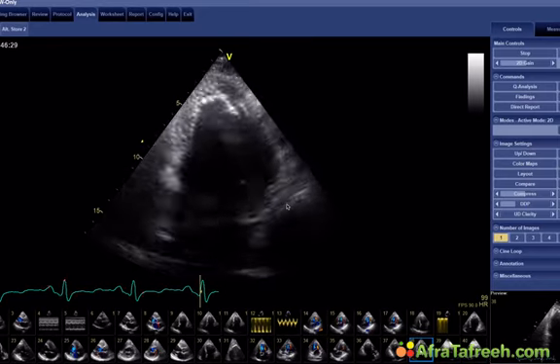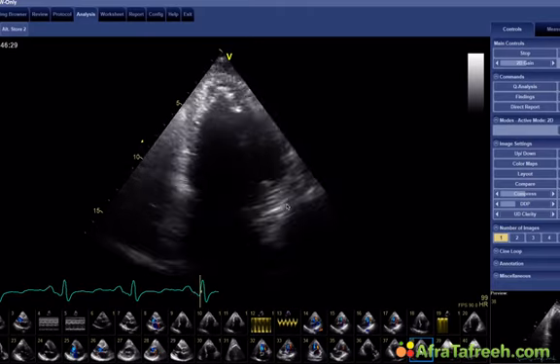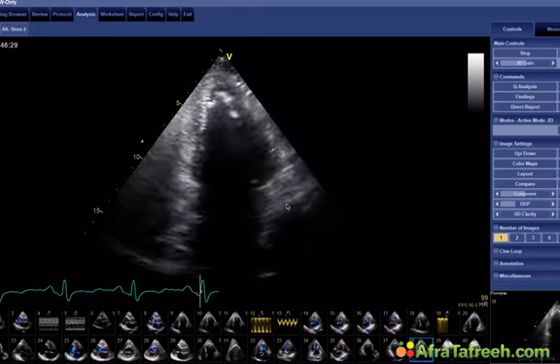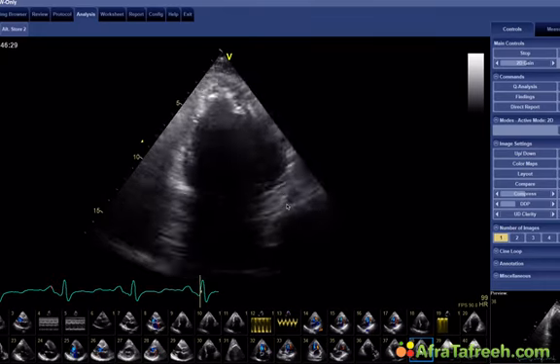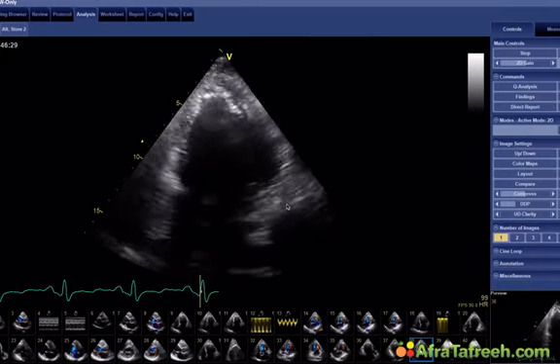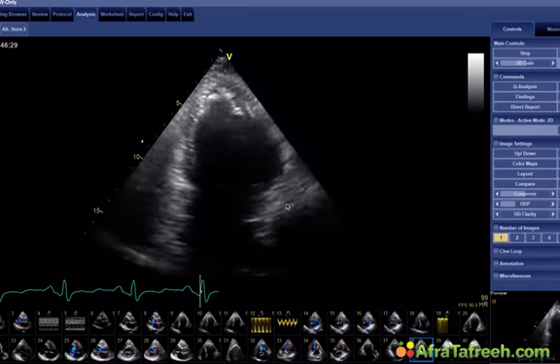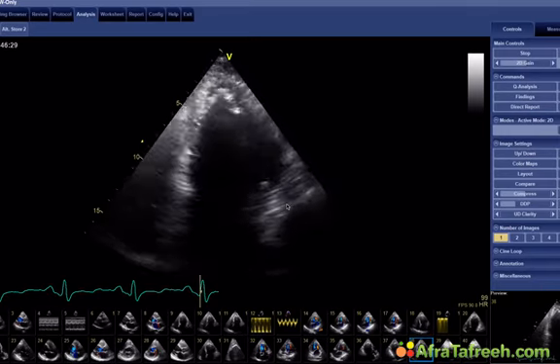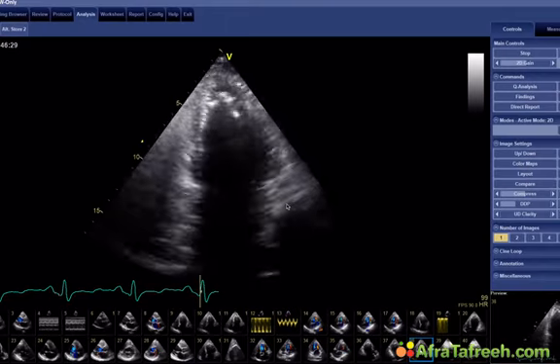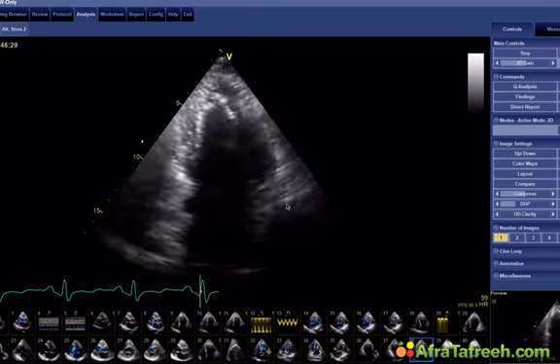Before, we were not so eager to send him to surgery because we were afraid that the mitral valve is very difficult to operate, simply because the mitral valve is thickened. You do not know exactly what to expect in this kind of pathology. It's not a normal mitral valve that one just simply operates. And obviously one could put a prosthesis in, but we were not happy to give a prosthesis in this patient who was fairly young. So at least a mechanical prosthesis.